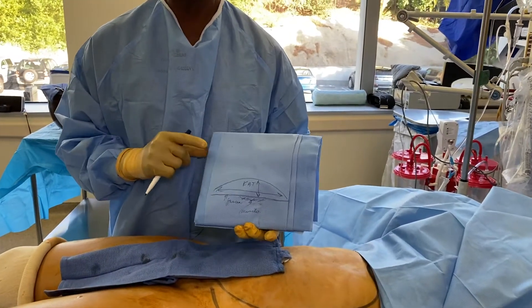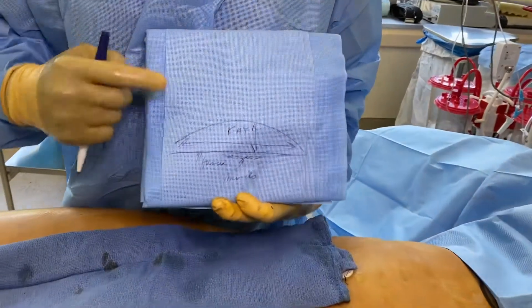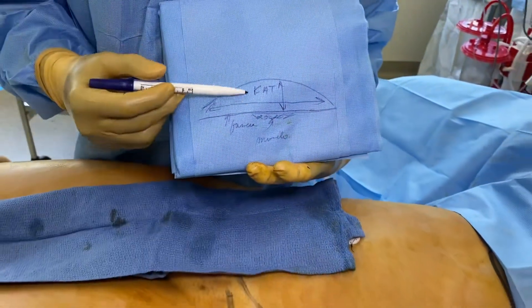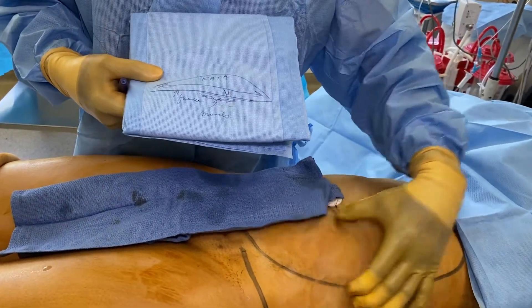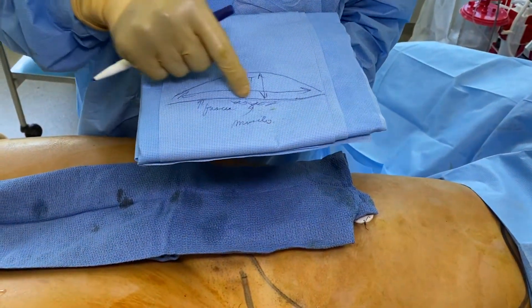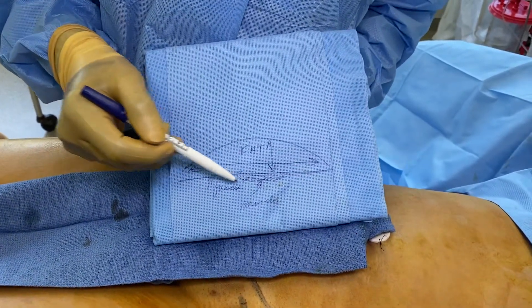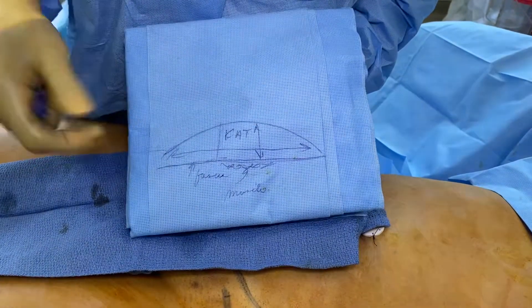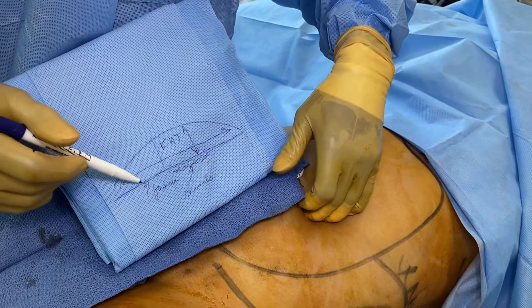I want you to understand exactly how liposuction works. If we look at this as the skin, and the fatty tissue here from here to here — fatty tissue, fat. Here's the fascia, the covering of the muscle, and then muscle. I'm pinching a fat layer. I push in hard, I feel the fascia and muscle. We're working all in the fat layer.